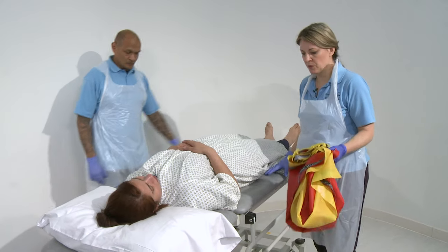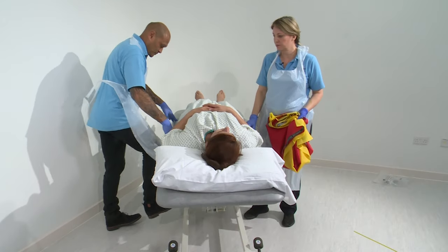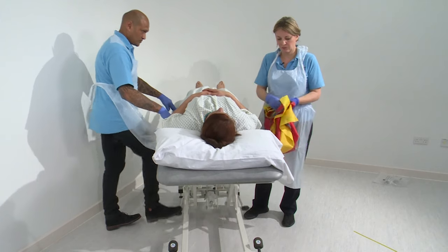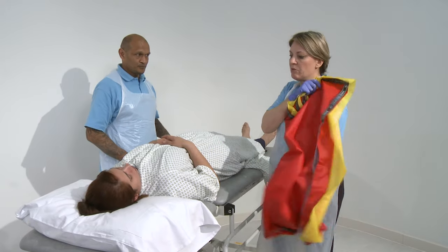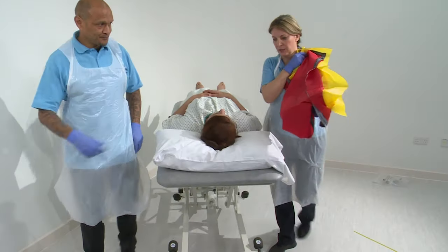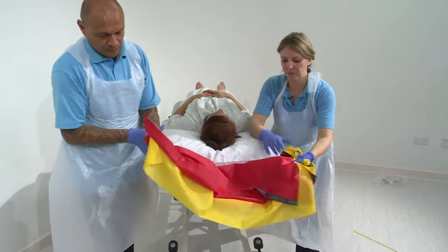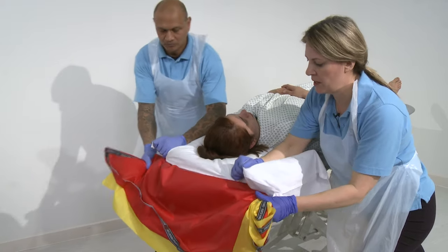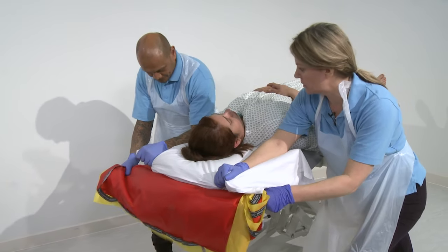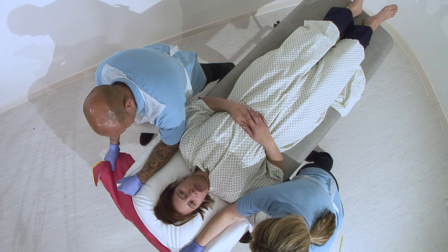Hello Neha. We're just going to put some slide sheets in. In order to do that we just need to bring the bed up a little bit for us. So what we're going to do is unfold these underneath you. We're going to take them in underneath the pillow, so I'm just going to pass this over to Rob. What we're going to do is put our elbows onto the pillow, taking hold of the slide sheet at the end and hold the pillow nice and still, pull it taut between us. Then all we need to do is transfer our weight backwards so that it comes right down to the shoulders. Ready, steady, slide.